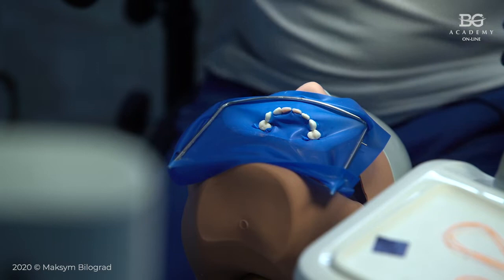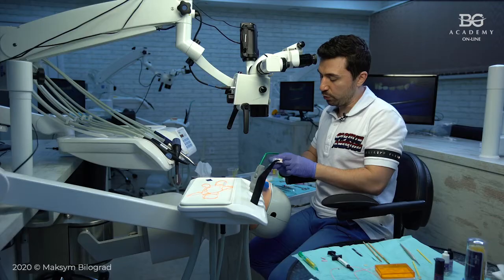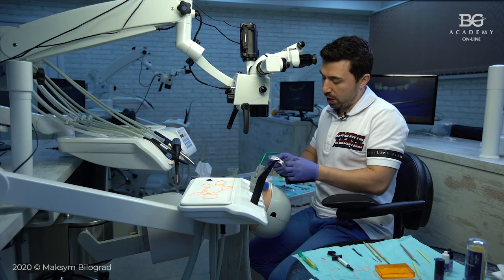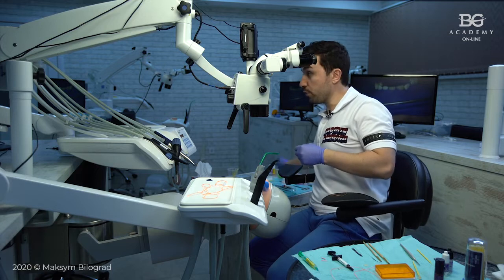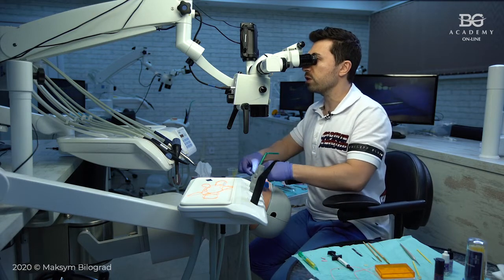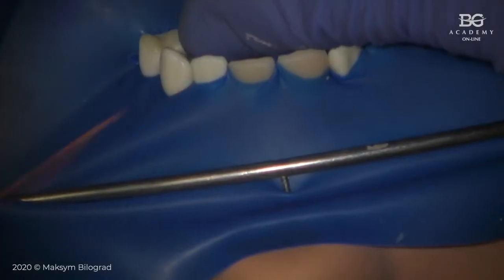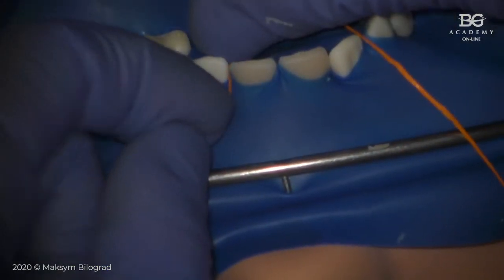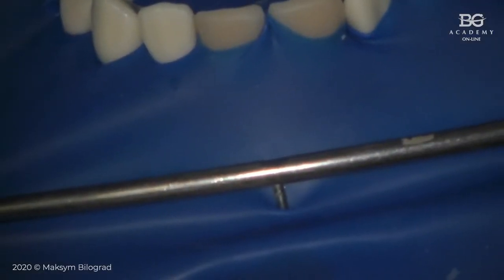Now I will take some floss to make a normal inversion, because once we expose teeth and put the rubber dam on the frame, afterwards we have to make inversion. Inversion is an important step, because if you forget to make invagination or inversion, you may get some leakage of saliva or bleeding, and your adhesive protocol will be compromised, not complete and efficient.